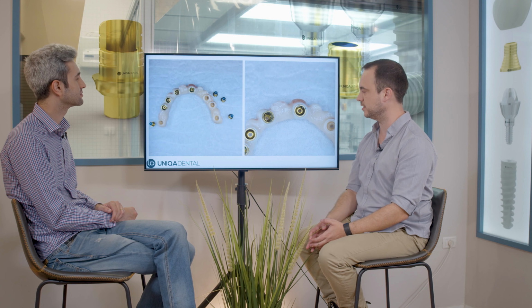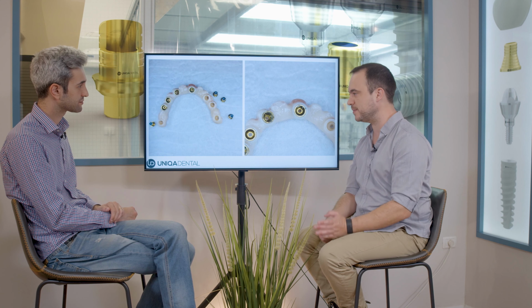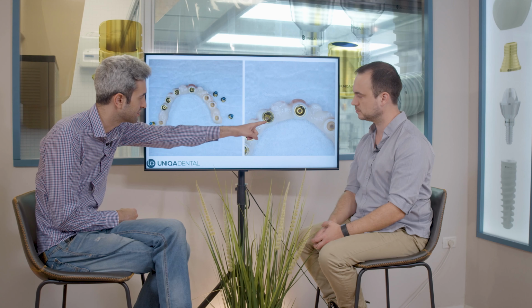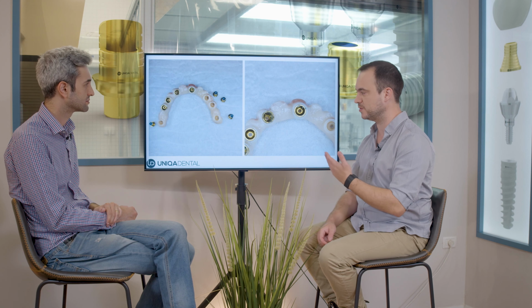With cement, first of all, in this case, the angulated abutments, the angulated sleeves. And then in the second place, we'll cement the straight ones, using the same method we talked about before. And I see you will clean the cement from inside those? Yeah, when you are cementing and you have some saliva or residues of the cement, you just clean it up a little bit. It's very easy to clean.